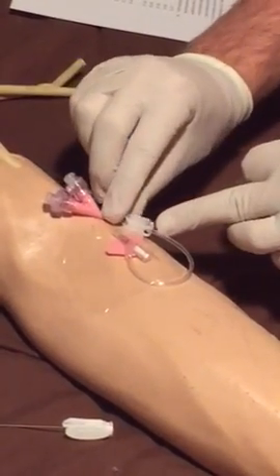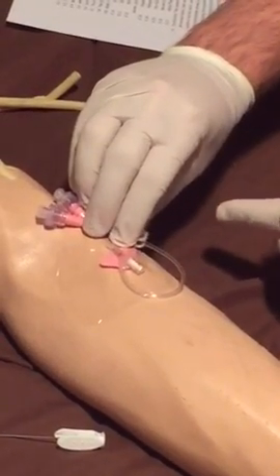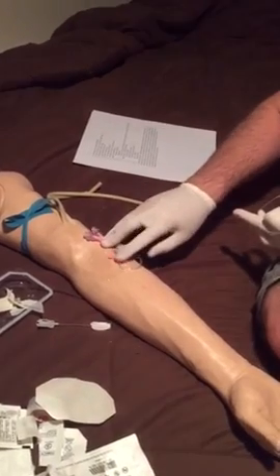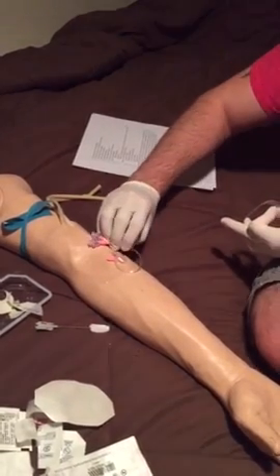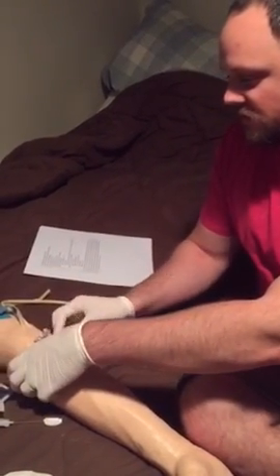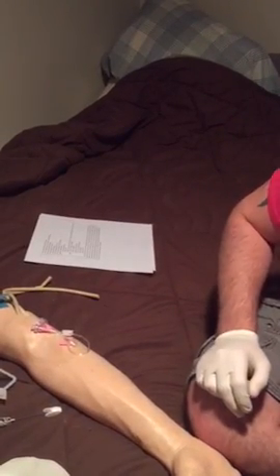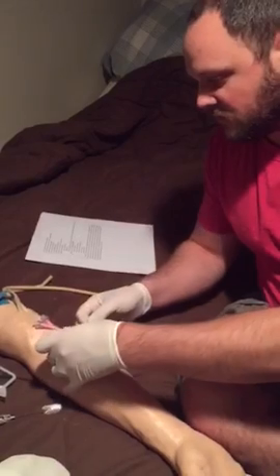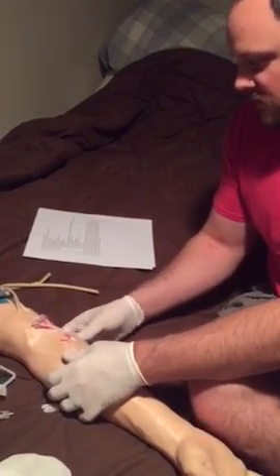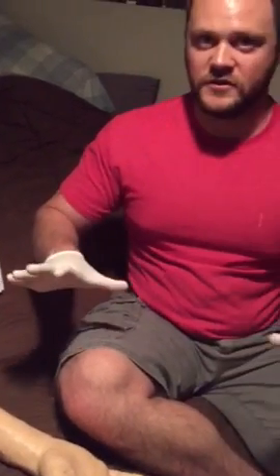These have clips on them actually, so if we're not actually going to run fluid, if we're just going to have an IV for access for pain management or anything like that, we can clip this shut so that blood does not back up into the tubing. And then we're just going to tape down here and seal it. And if you're really kind of anal about everything, you can do it one more time just to make sure there are no loose ends. And then after that, and securing it, we would adjust our flow rate.